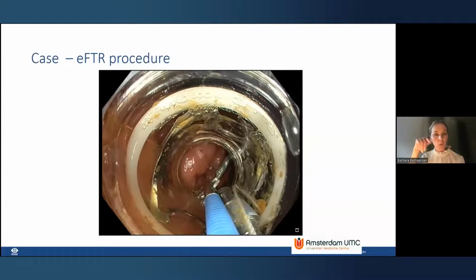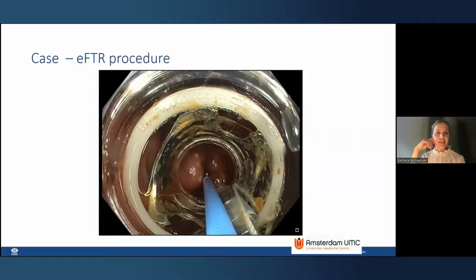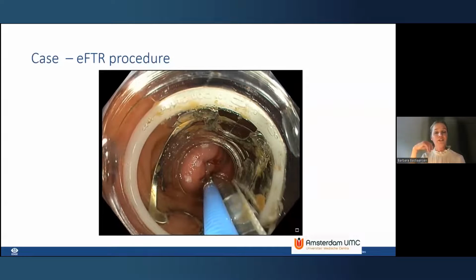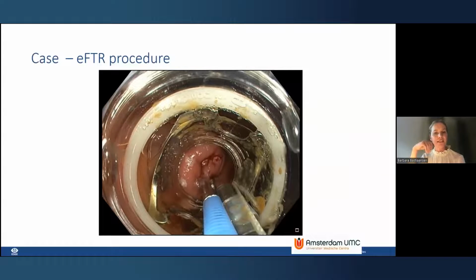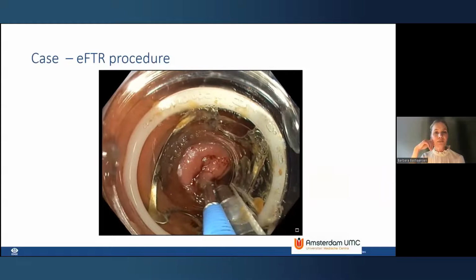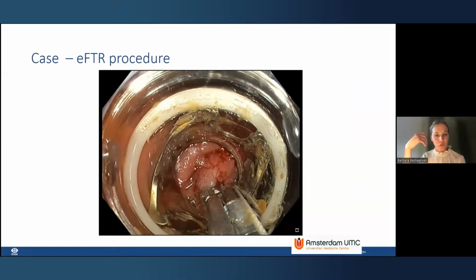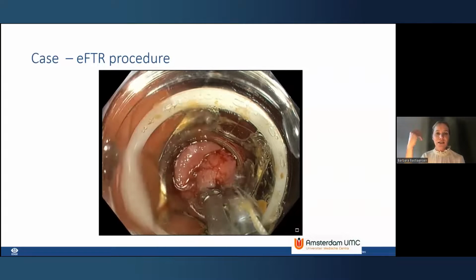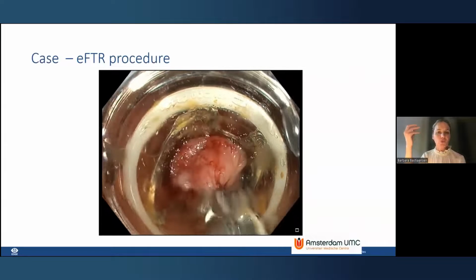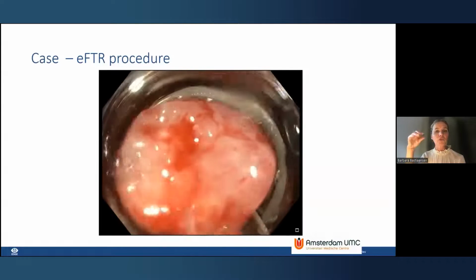You see the markings are quite tight over the edges of the lesion, not like ESD, where we take a longer distance, but here the markings should be just around the lesion so that you can see whether you pull your lesion in completely. Now, first pulling, no suction yet. First, put some tissue in the cap before you apply additional suction. And I'm pretty sure very often we do need to apply some additional suction to get everything in. But don't start with suction.